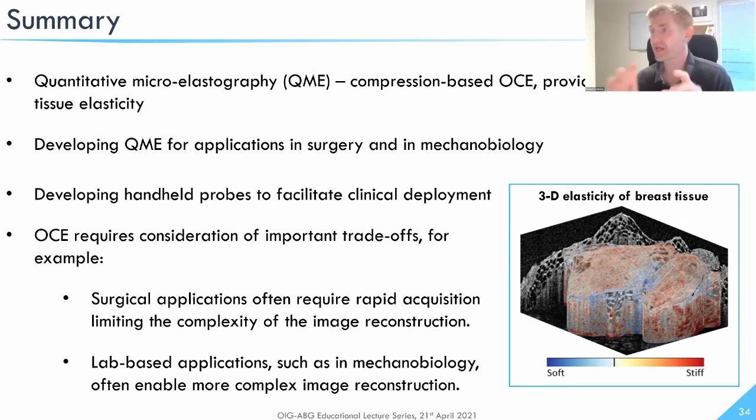By now that we understand how the spatial resolution is formed, we really need to go after each aspect of that. So we're looking at improving the OCT resolution or OCM resolution, the signal processing. So we're looking at detailed analysis of speckle to try and understand how we can reduce the range over which we perform the linear regression, and also, probably most importantly, the mechanical deformation, and using that inverse elasticity solution, for example, to try and greatly improve the spatial resolution.